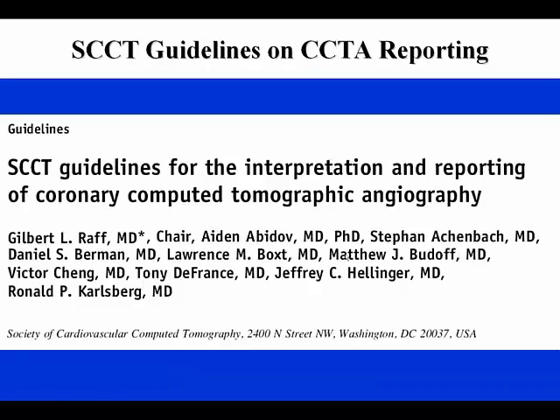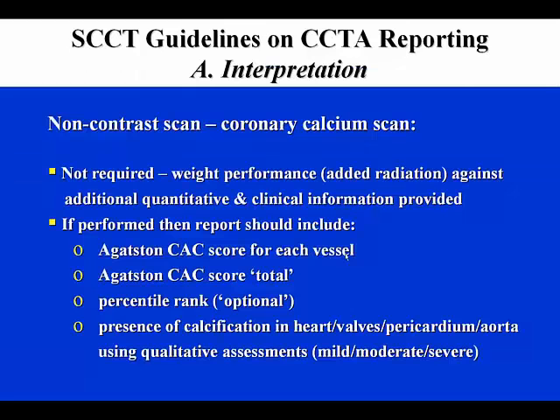The Society of Cardiovascular Computed Tomography has written an authoritative paper on guidelines for interpretation and reporting of cardiac CTA, which will be reviewed as follows.